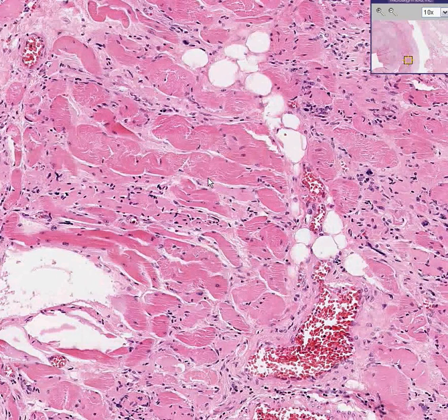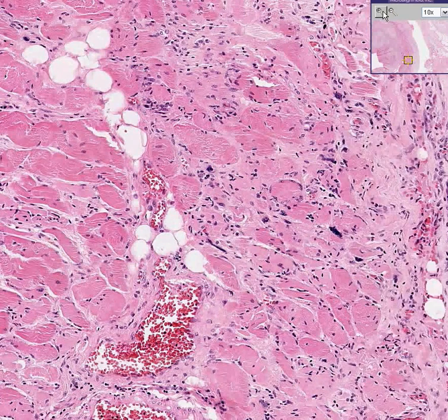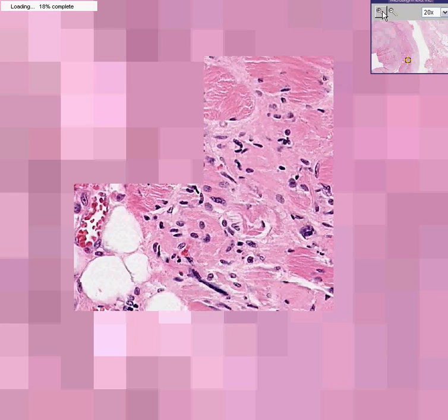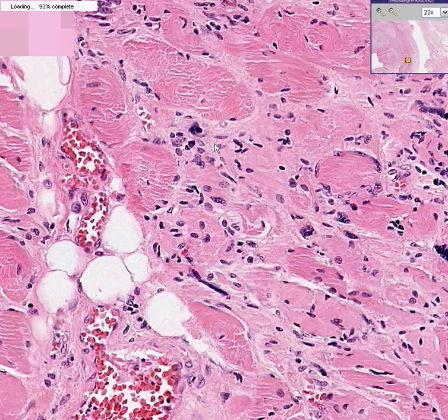Look at the nucleolus on that cell. Look at the hyperchromasia of that cell or perhaps small group of cells. This is a classical appearance of a linitis plastica, poorly differentiated adenocarcinoma infiltrating often in individual or signet ring cells diffusely throughout the full thickness of the stomach wall, making it look like a leather bottle.